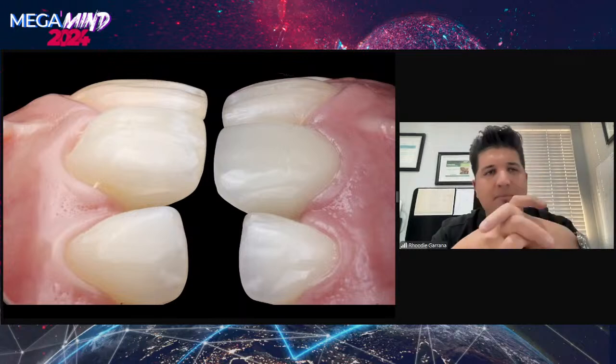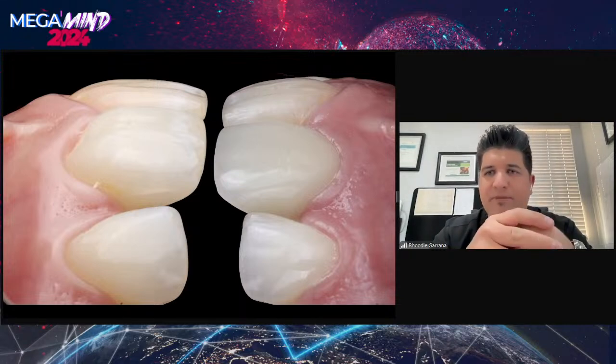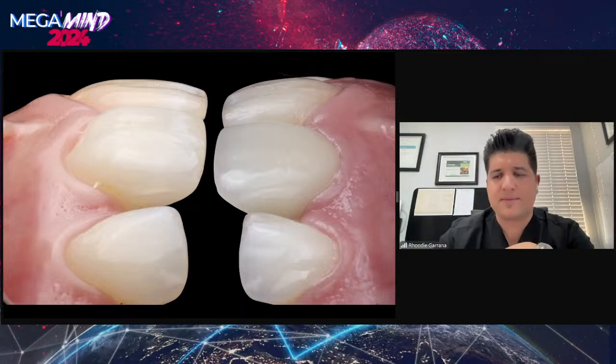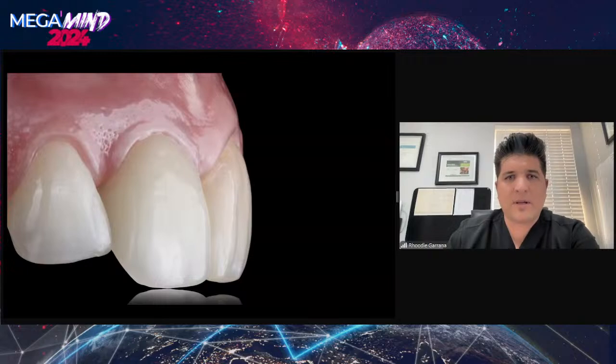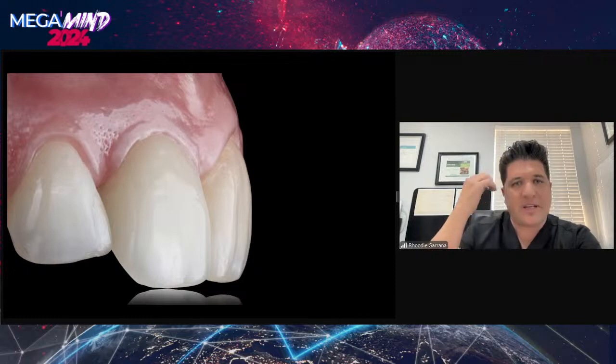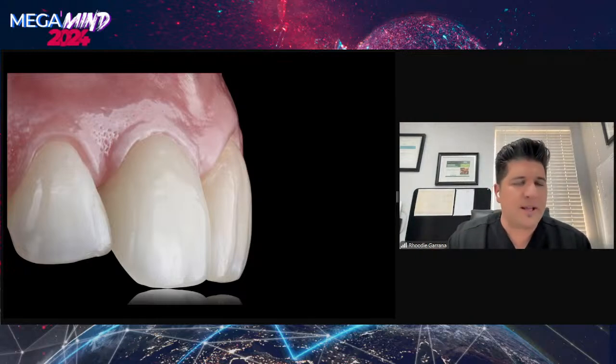And once again, I'm a periodontist. I don't do any final restorations. I send them back to their clinicians for restoration, but these are my provisionals. So this is a provisional that the patient kept for 6 months. And then we can see after 6 months how beautifully the soft tissue is healed around that crown. And I think at this stage, the patient and the restorative clinician has a much easier task of restoring, and our job here is done.